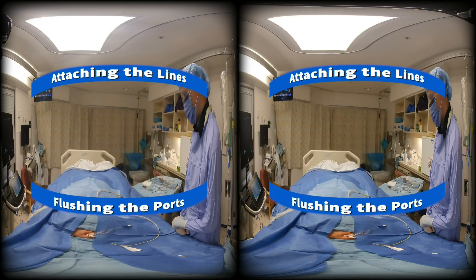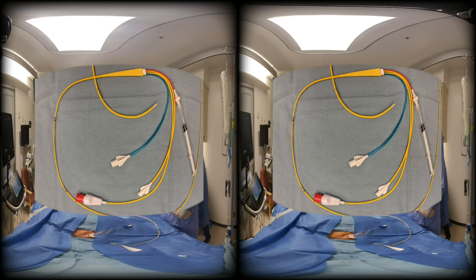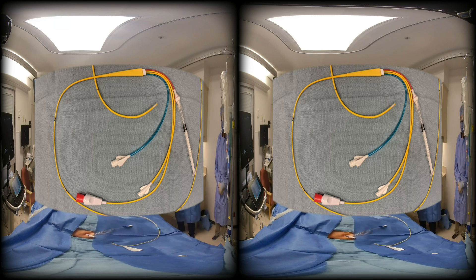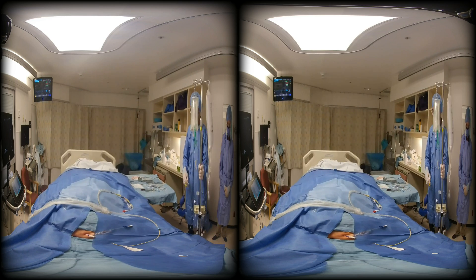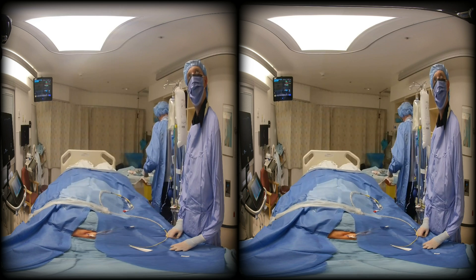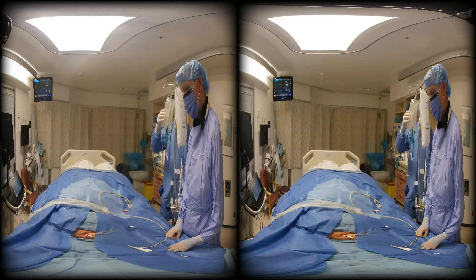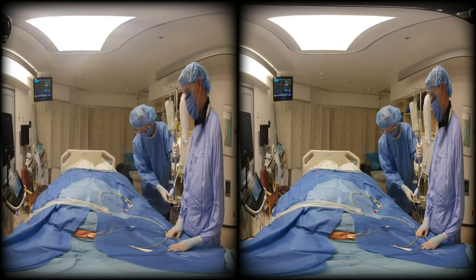The next step is to attach to the pressure transducers and flush the catheter with your assistant's help. The blue port is attached to the CVP or blue line, and the yellow port is attached to the PA or yellow line. Be careful — it is a common error to reverse these two lines. Then you need to flush all these ports.